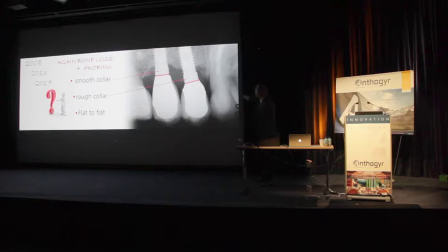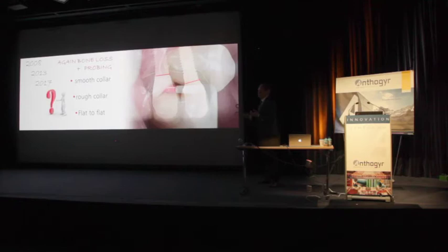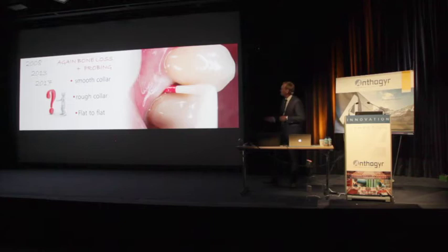But now look at this area. My first implant is getting the same disease, and this is why I did not really sleep very well during the night. So it's a danger. How can these implants survive better? So we have a flat-to-flat connection. And that was, for me, a trigger point.